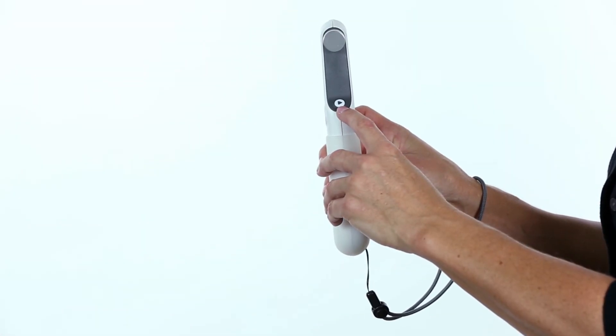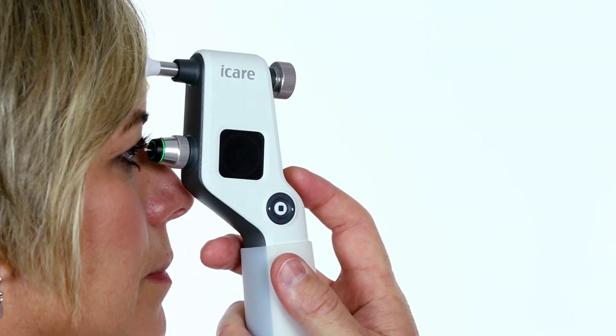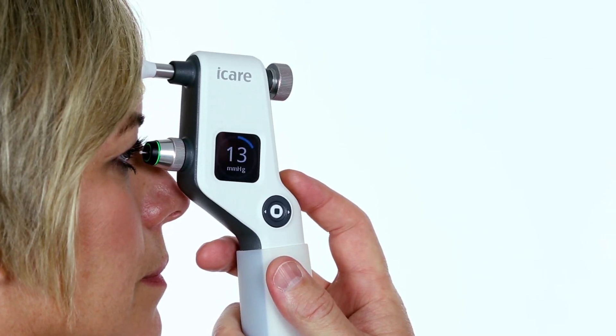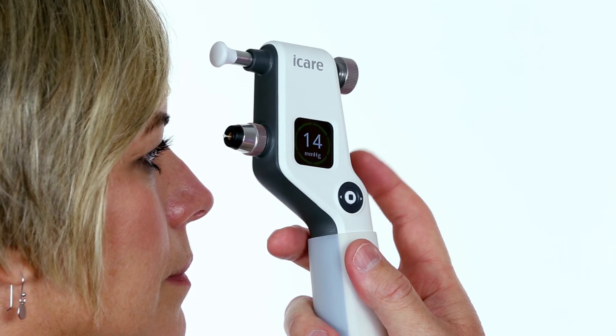Press and hold the measure button to perform the automatic measurement in a series. Six measurements are taken consecutively. Once the measurement is complete, you will hear a long beep, and the final pressure will show on the display.